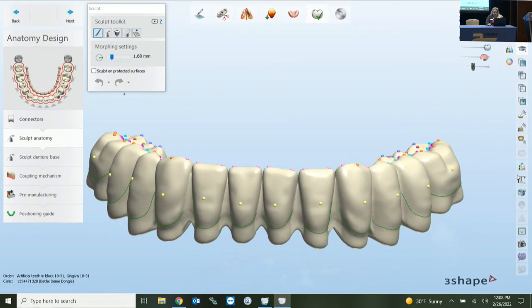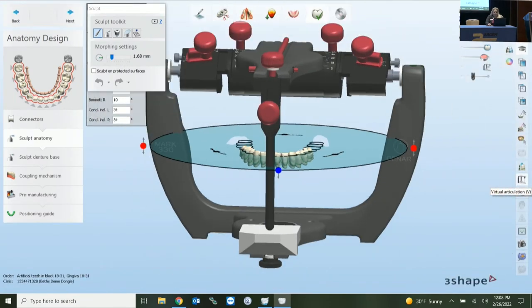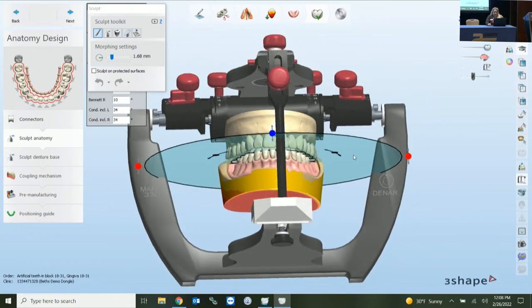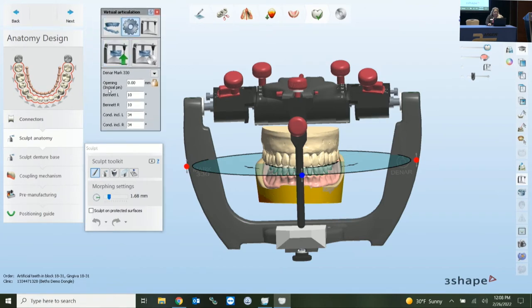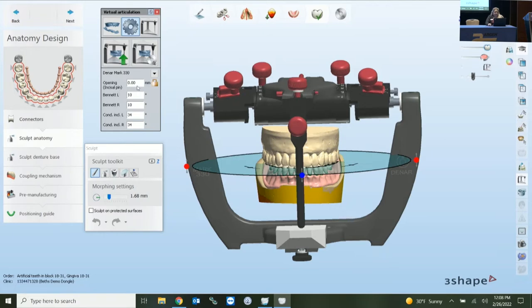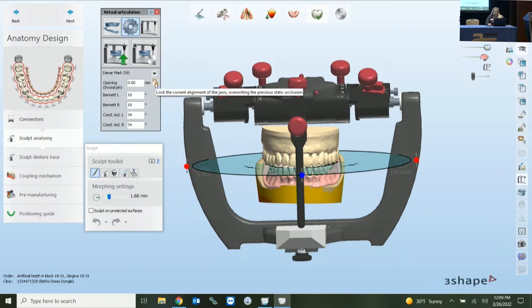On the right hand side, clicking the Articulator Visual brings in the virtual articulator. On the left, this box is your virtual articulation. You can change your incisal pin — normally you'd change your bite prior to designing, but you still have the option to change your bite configuration at this point. The purpose here is to go through excursives and make an adaptation based on your design. You have your open incisal pin, Bennett's angle settings — anything you change here you'd want to lock before doing anything else.